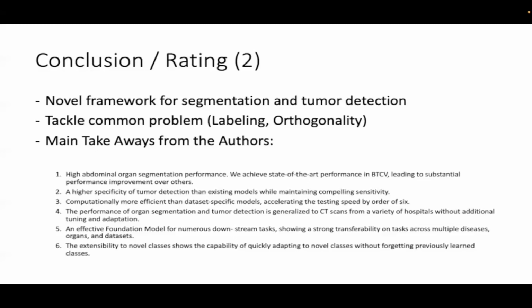Finally, noting that overall, the model is 6 times faster than the next comparable model here. So overall, in evaluating this paper, the authors have proposed a very novel implementation of CLIP for utilizing partially labeled data sets and tackling previously mentioned problems.